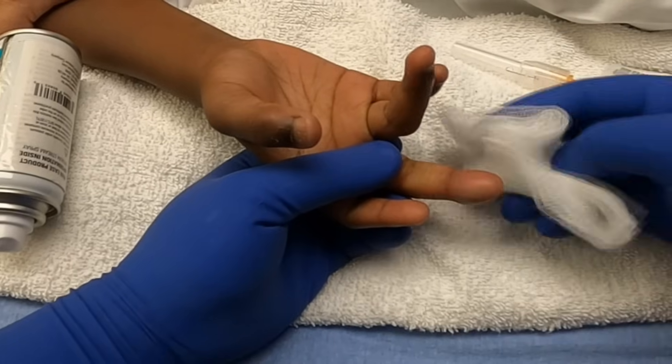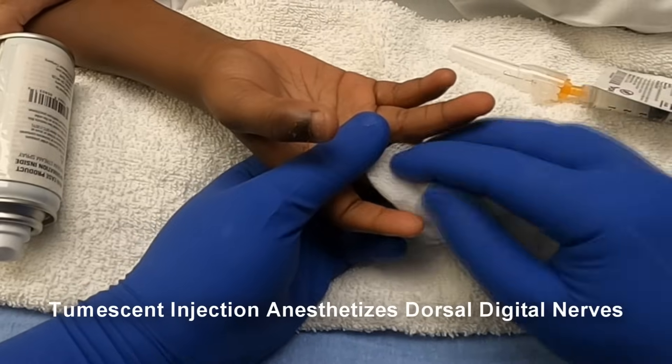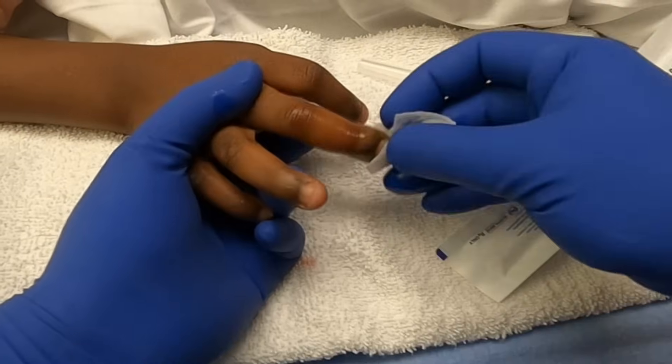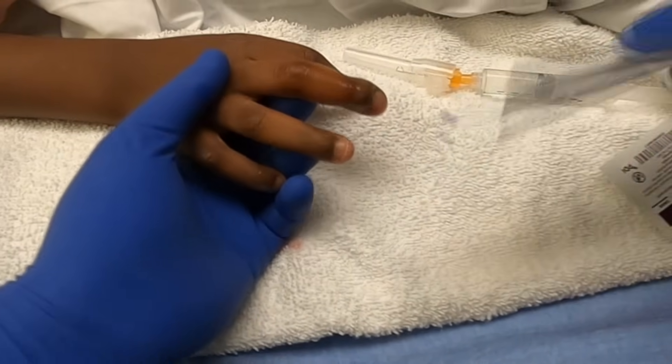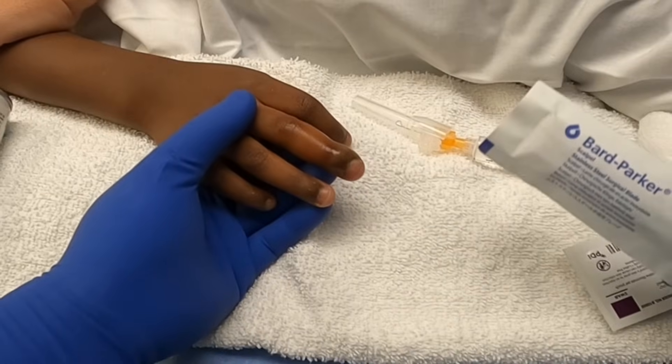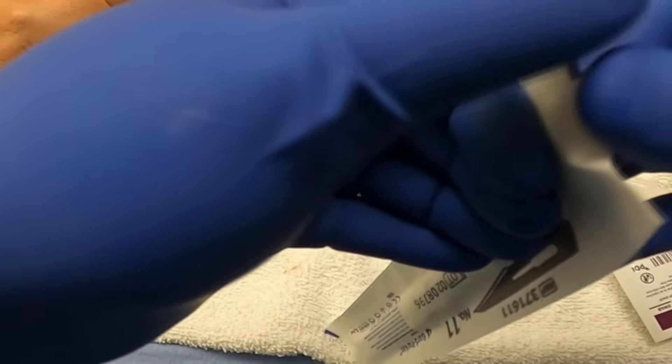You can see the finger looks pretty tense now, distended with the lidocaine. Is your finger starting to feel a little numb? Can you still feel your finger? Can you feel them touching your finger? — Yeah.